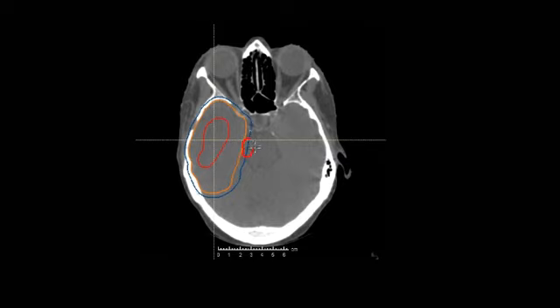Also in the OAR, I might have a hot spot here in the OAR, the brainstem in this case, a big hot spot. That would give you some DVH. Or instead of that, I might have many small hot spots. So those would give overall the same volume to that high dose. The DVH would look the same, but I think you can imagine that biologically these would also be quite different plans. So there are some limitations of this DVH approach.